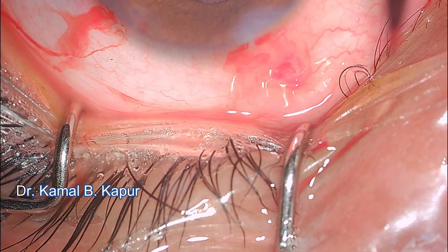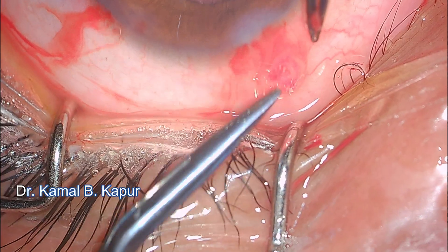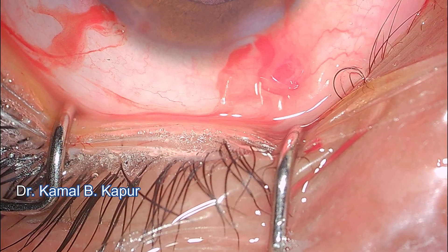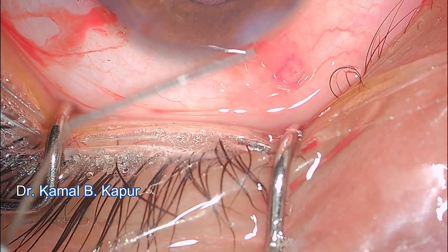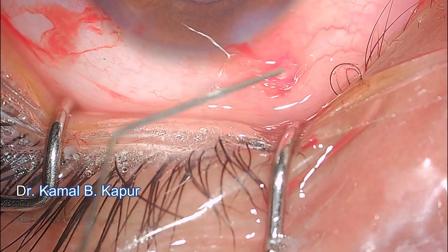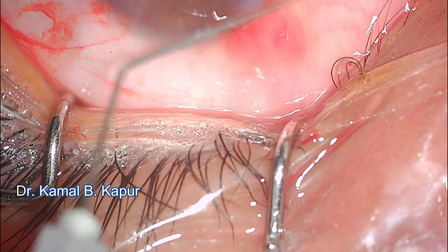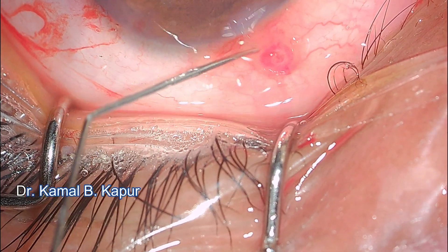I go in to snip the glass foreign body embedded in the fibrosed conjunctival cyst. I ensure no glass remains and check whether there is any aqueous leak or opening into intraocular tissue. This is a fibrotic adhesion between Tenon's capsule and the conjunctiva. I break as many of these adhesions as possible and the glass foreign body is removed.